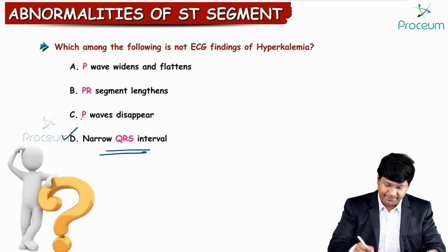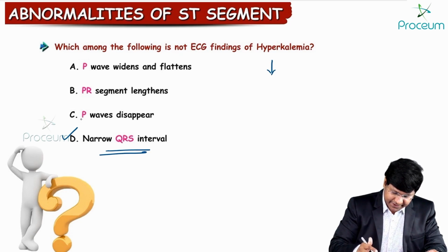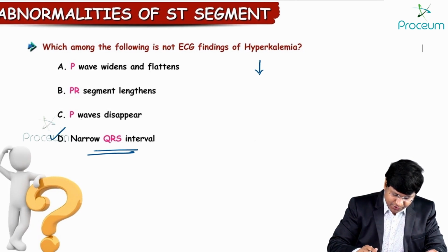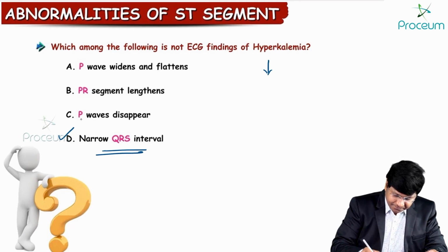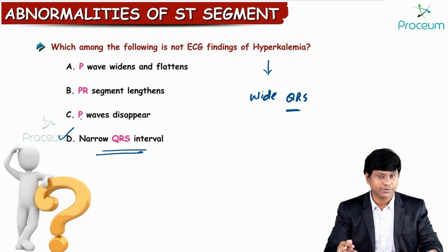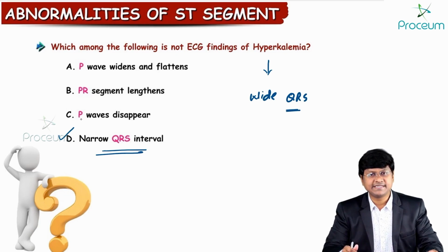Remember, in patients with hyperkalemia, you will have the presence of the wide QRS complex. You will not have the narrow QRS complex. Okay. Now, the next important point is, what are all the other ECG changes in hyperkalemia?